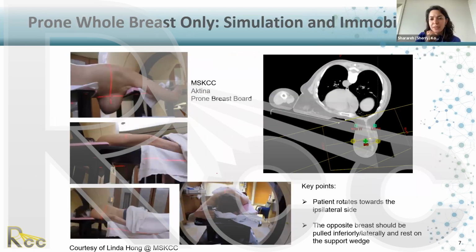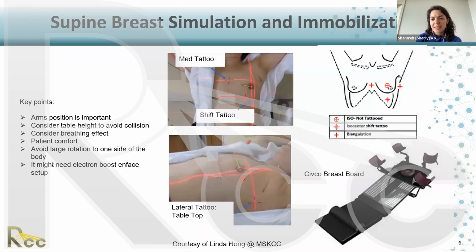Sorry, yes. There's a question from Andrea. They're asking how well does surface guided radiotherapy, SGRT, work with the breastboard? For the typical two-field breast, four-field breast, surface guidance is really good for the initial setup, especially the arm position matching, pretty good.